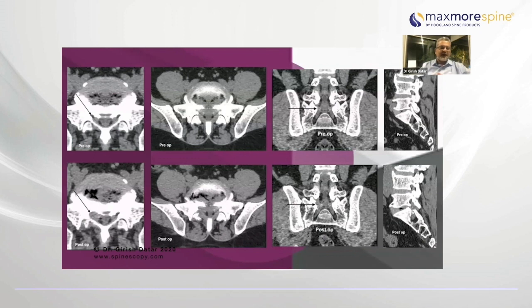These drills don't cut ligamentum flavum, and ligamentum flavum needs to be taken off with Kerrison rongeurs or laser. You can see this overhanging part of the superior articular process here. This is the inferior articular process. Now this overhang of the superior articular process is completely gone here. It is not seen. This is the medial part of the pedicle, that is the medial-most bulging, which is reducing the interpedicular distance. And this medial part of the pedicle is now gone. And this is the tip of the superior articular process, which is completely gone.